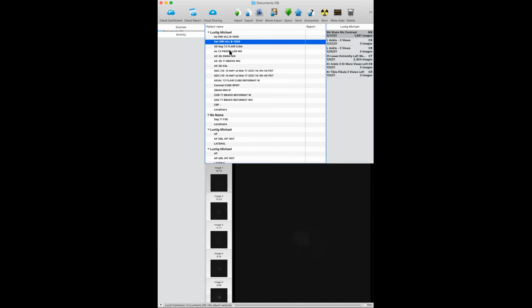The phase will depend on where they are in space. And so if spins are moving, then the 180 is not going to refocus them perfectly. And if they're not moving, or very little diffusion happens, then the signal is just going to be the regular T2. So that's a very important sequence, but it's acquired using echoplanar imaging.